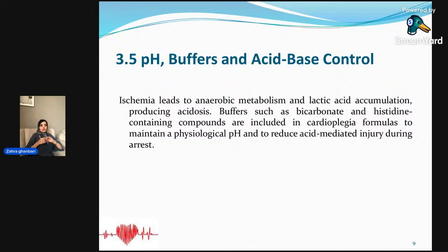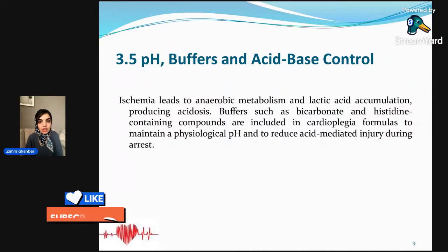For a child this is very good, because they are so sensitive to hypoxia, and by this vasodilation we prevent ischemic injury. But for an adult it is dangerous, because this vasodilation may activate the Cushing reflex, and maybe lead to movement of emboli.